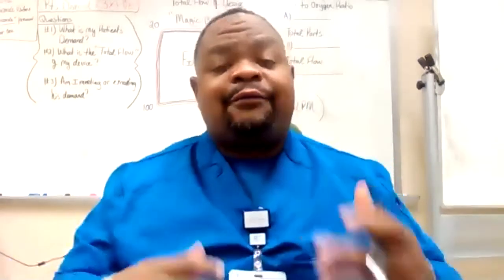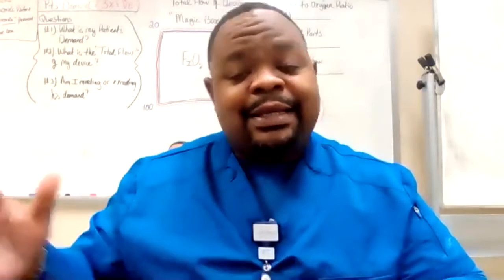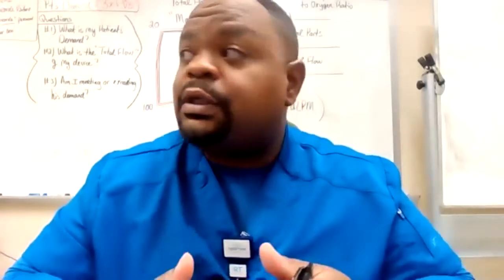Yesterday, we left off with the high flow systems, talking about the criteria for high flow systems: those that did not qualify for low flow systems. So if they were breathing more than 25 times a minute, your tidal volume was not 300 to 700-ish, and you're not having a consistent ventilatory pattern, then that person needs to be on a high flow system. The low flow systems, we said, were people who are breathing regular, right? Oxygen might be a little low, but they're breathing in a normal, consistent pattern. So we can use a low flow system.